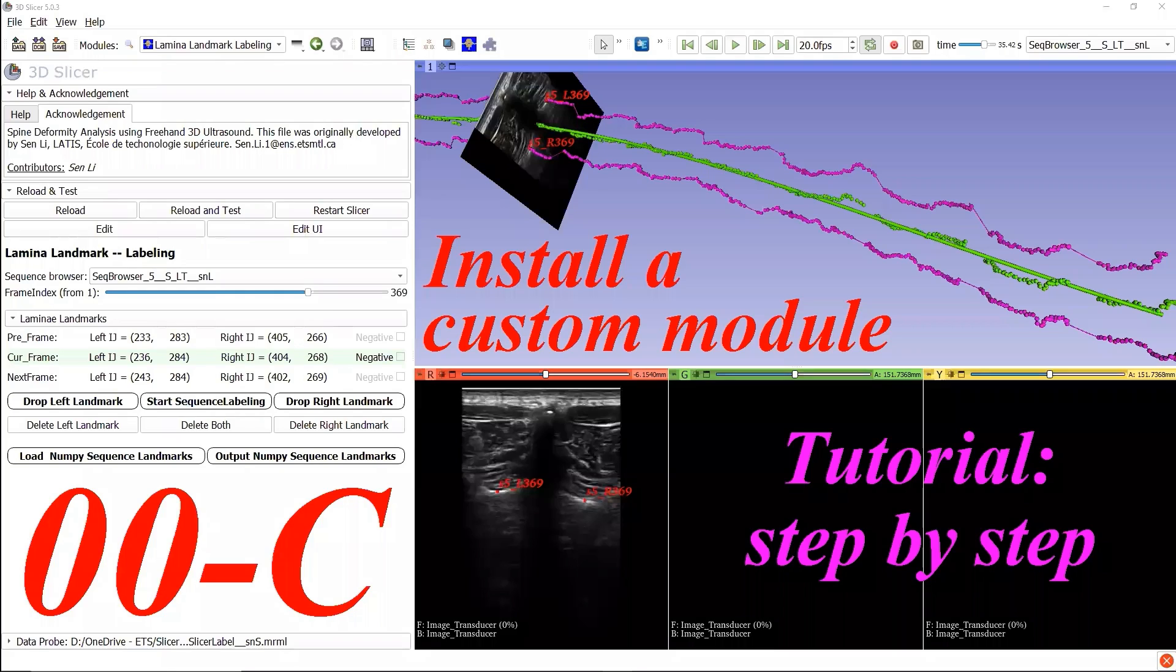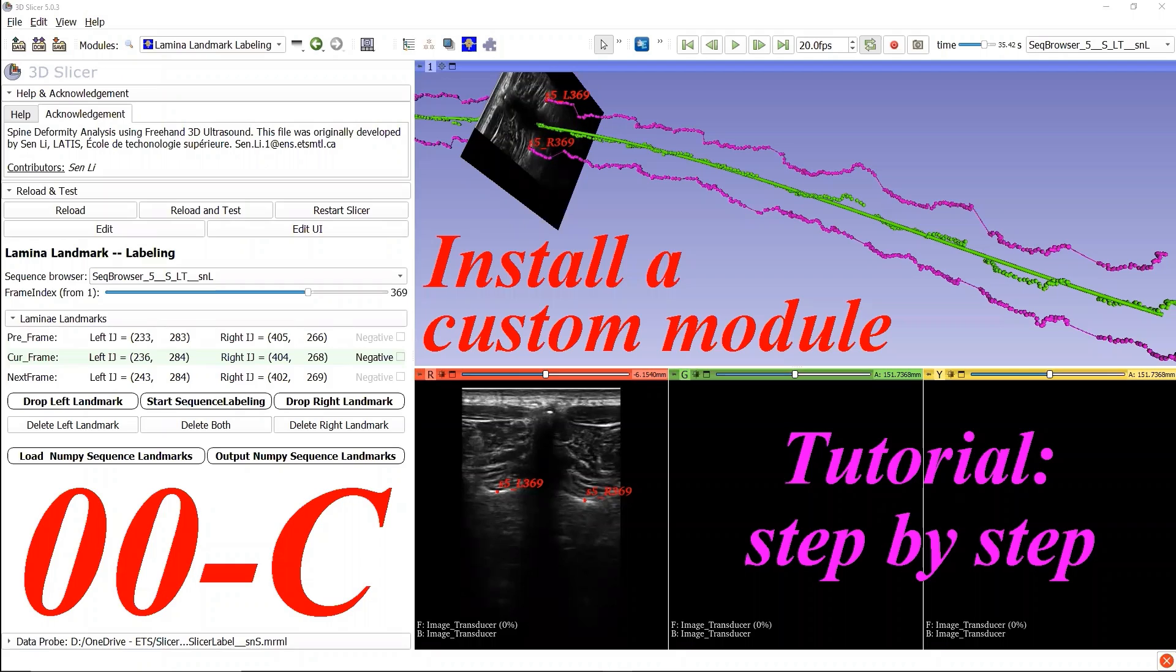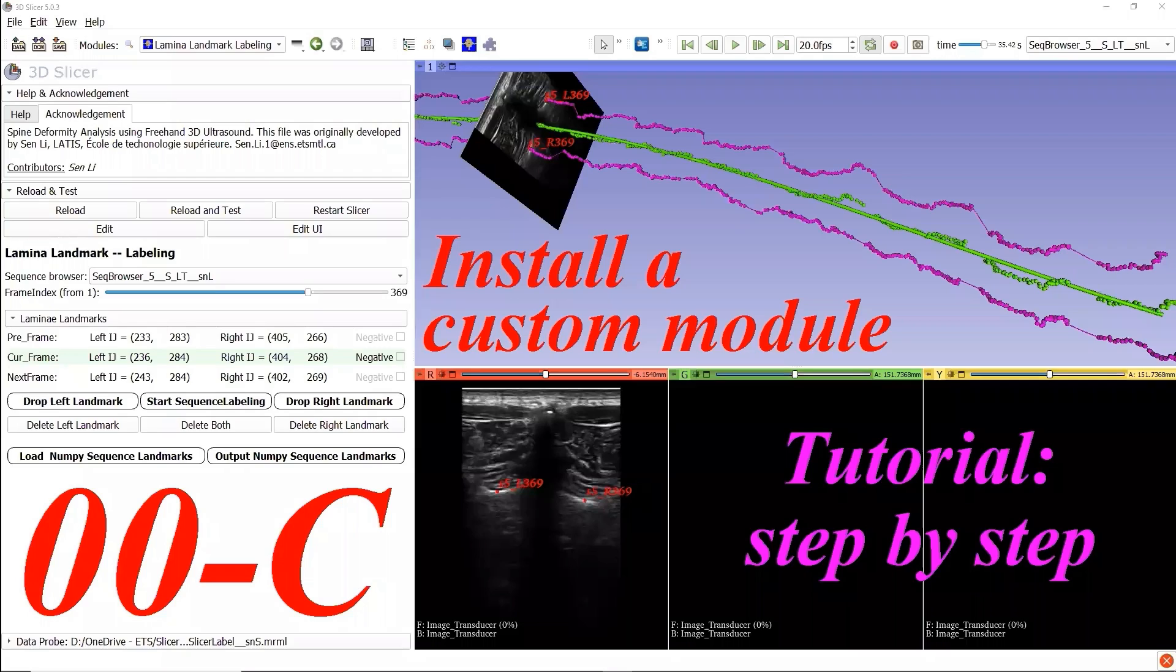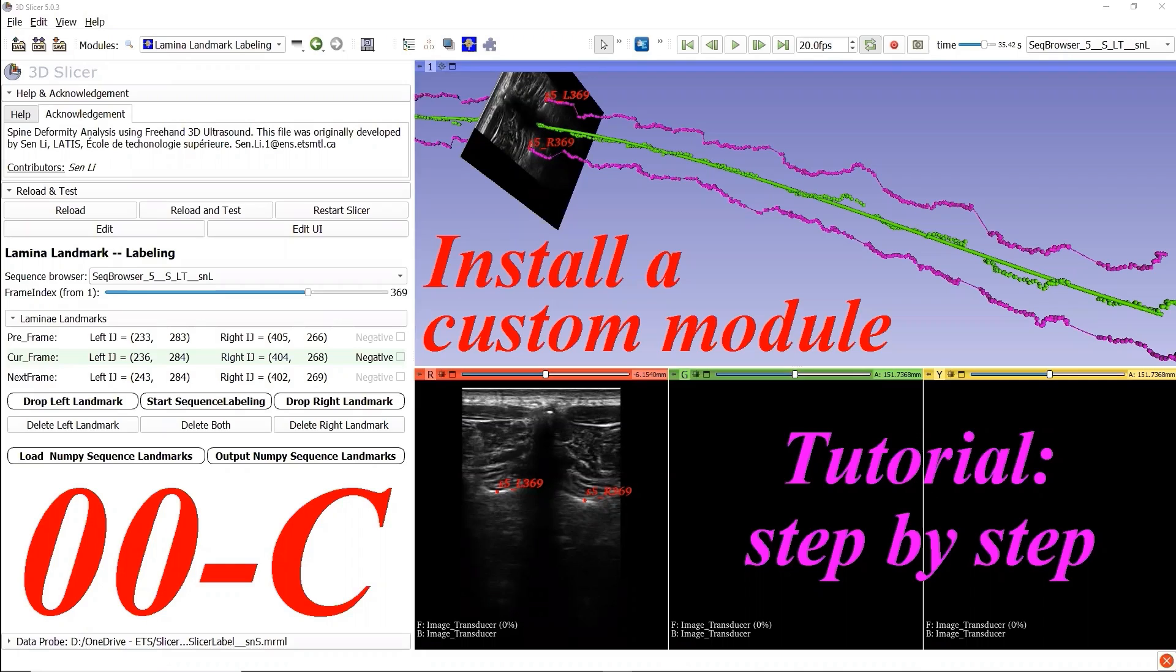Hello, welcome to this step-by-step tutorial on developing a 3D Slicer extension. My name is Sen Li. In this video, I will show you how to install the custom extension module Lamina Landmark Labeling.